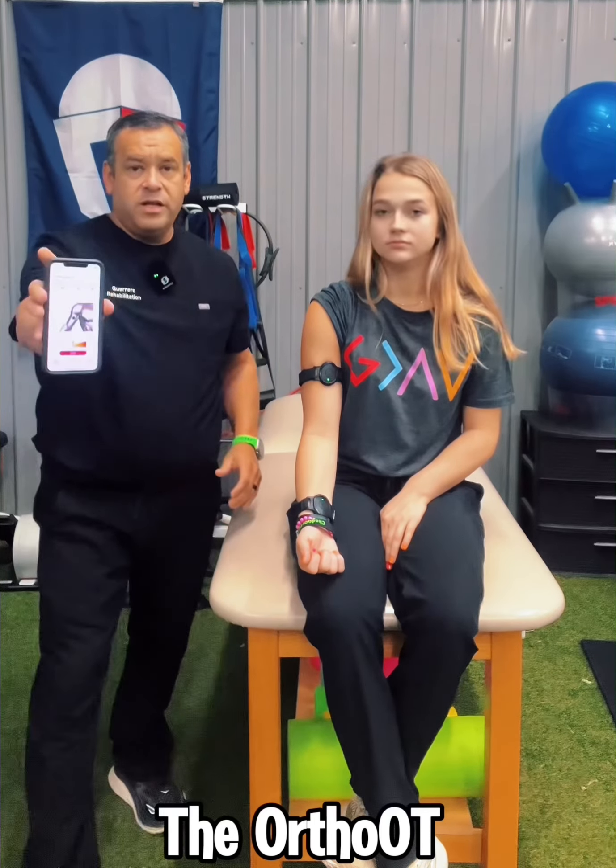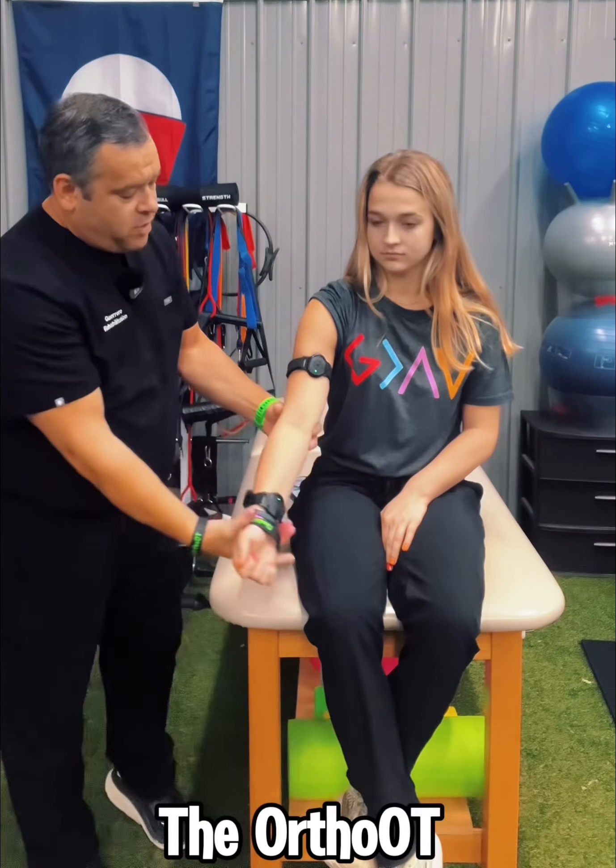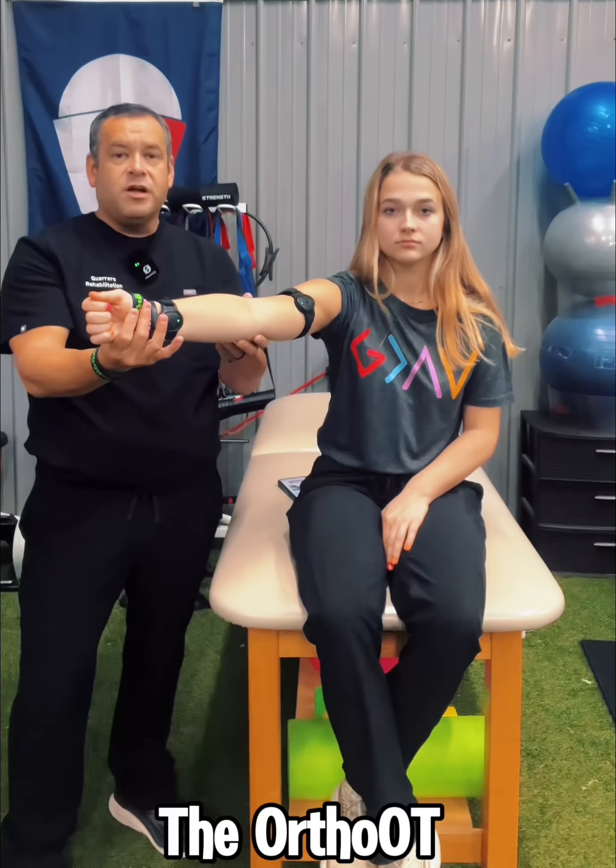So what I'm going to do is go to the free app, go to performance, and select arms. I'm going to hit the start button — I've turned it on here — and I can adjust the intensity.